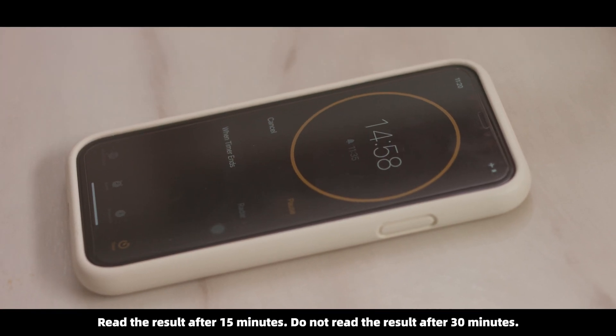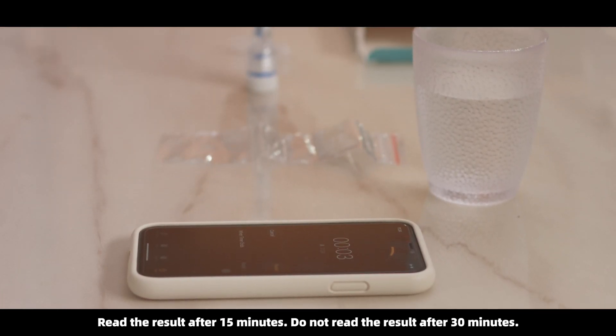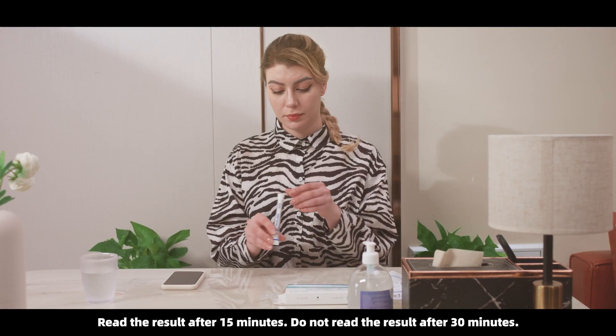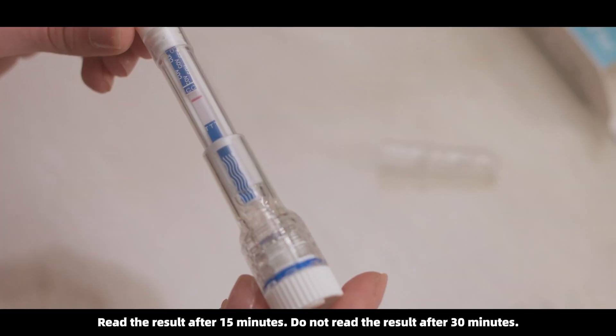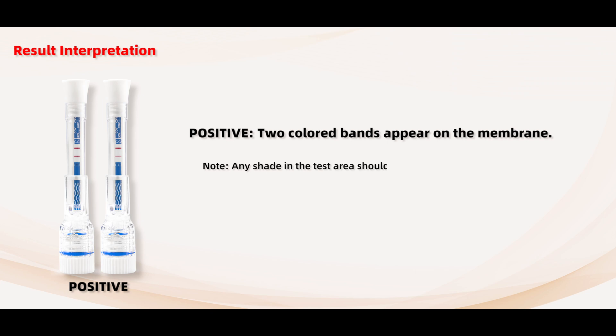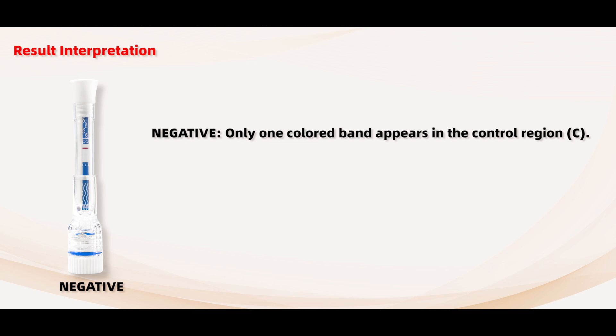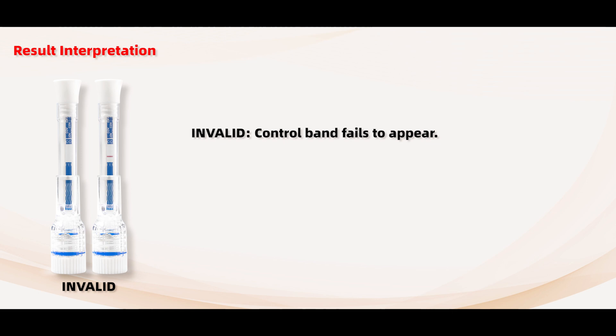Read the result after 15 minutes. Do not read the result after 30 minutes. Positive: two colored bands appear on the membrane. Note: any shade in the test area should be considered positive. Please follow local guidelines for self-isolation. Negative: only one colored band appears in the control region C. Invalid: control band fails to appear.